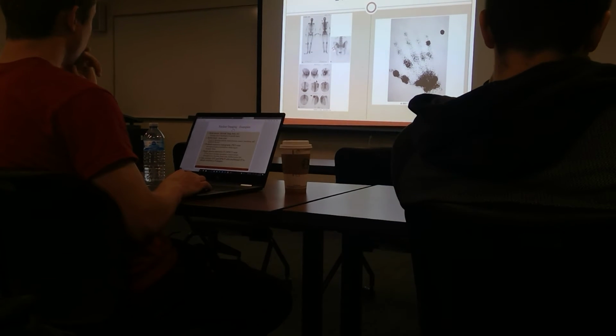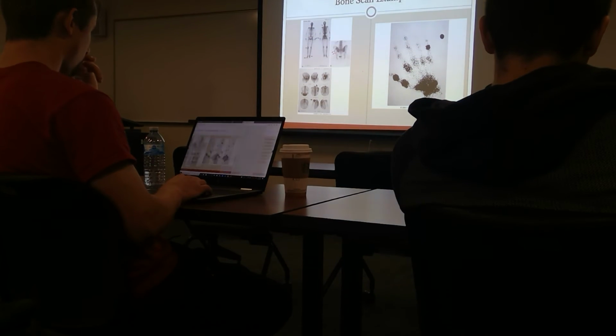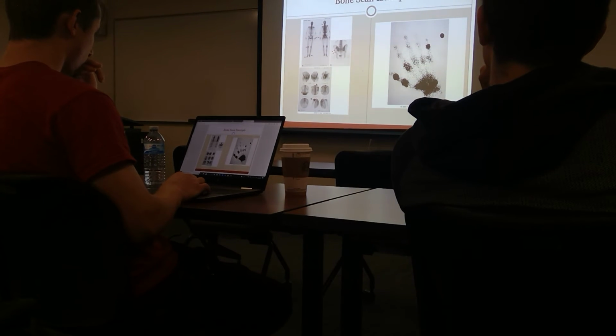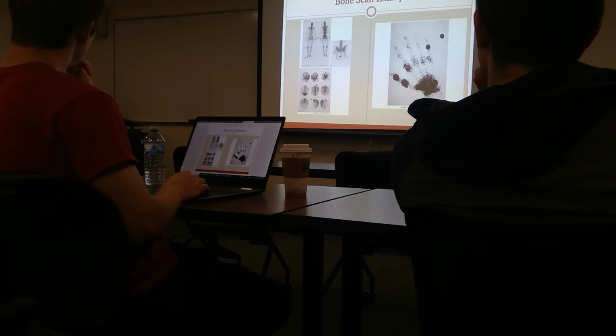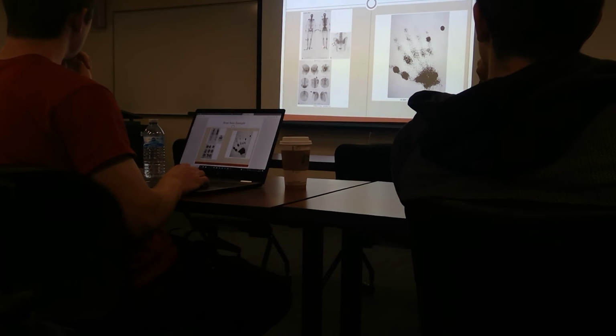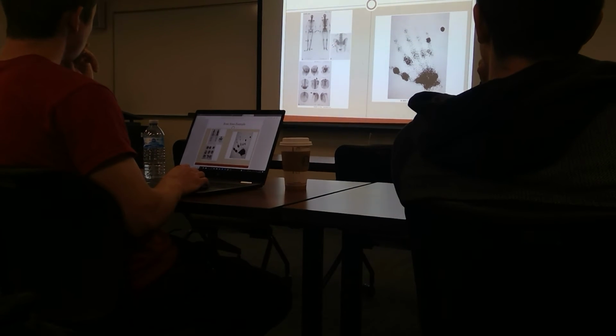Notice that we got a little bit of uptake right here. What muscle lives right over there? See, everything else is fine, but there's an increased uptake right here. We don't know. I mean, is it TFL or what? Or if it was more on the posterior side, what would it be? Or more on the lateral side? This actually, with additional testing, was myositis ossificans in the gluteus medius.